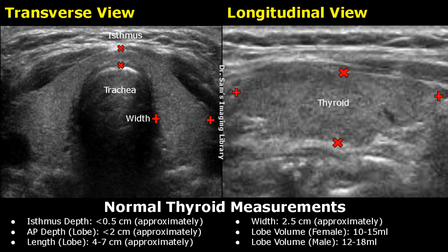Hello everyone, this is Dr. Sam and in this video, we will learn how to measure the thyroid on ultrasound. In the transverse view, we can see the isthmus and both the lobes of the thyroid.